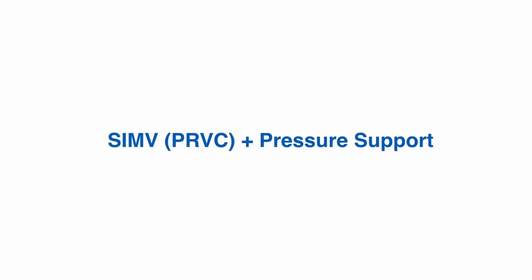So we've now discussed pressure control, volume control and PRVC, and you can see now that the mode I want to tell you about, SIMV PRVC with pressure support, I've explained a third of that. I've explained the PRVC bit. So for the respiratory rate that you set, your control breaths that are delivered are going to be of the PRVC type. But they're not just PRVC, they're SIMV combined with PRVC.